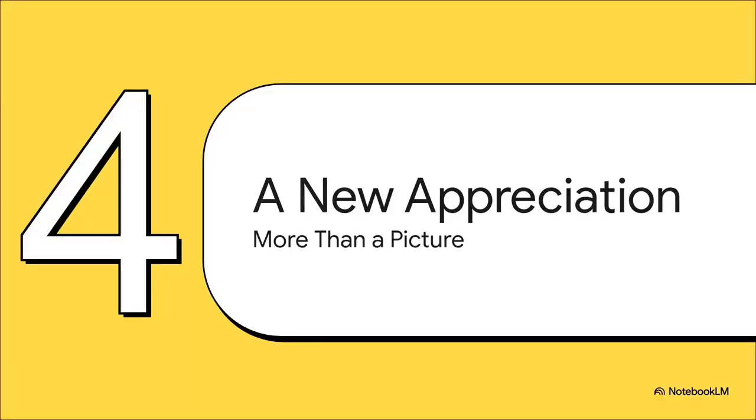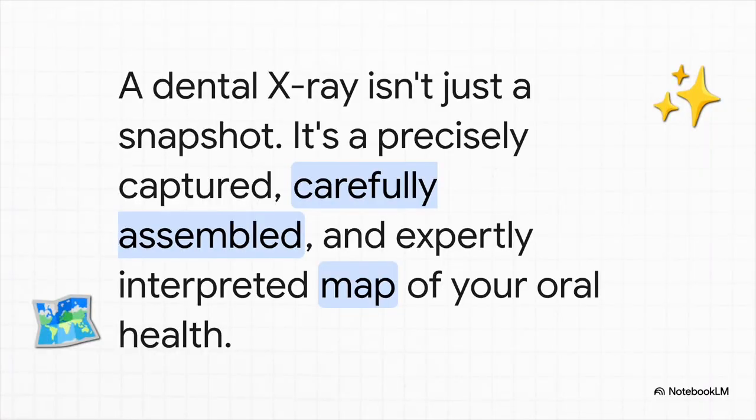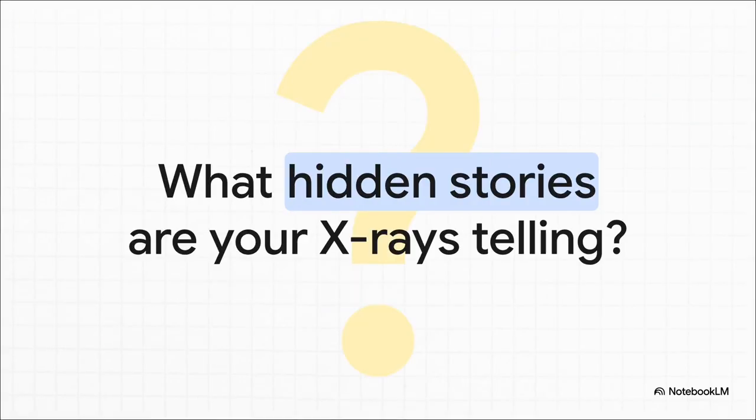So, when you step back and look at the whole picture, the clever geometry, the careful puzzle solving, the expert detective work, it kind of gives you a whole new appreciation for what seems like just a routine procedure, right? So the next time you're in that chair, biting down on that little sensor, you'll know what's really going on. It is so much more than just a snapshot. It's a precise application of geometry, a meticulous assembly process, and a detailed diagnostic map that is absolutely essential for your health. And that kind of leaves us with one last big question.